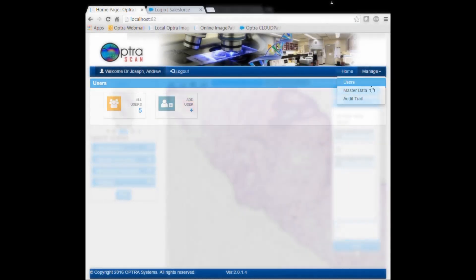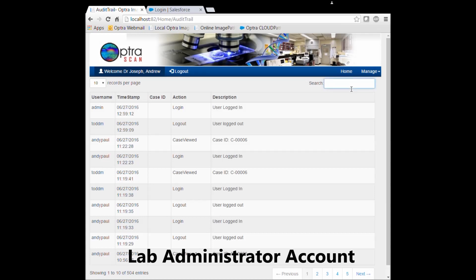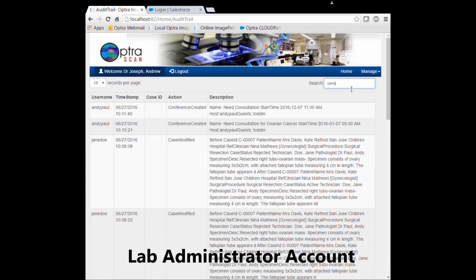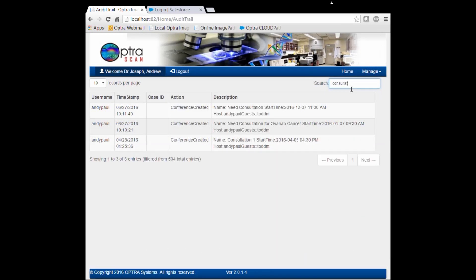Since we are 21 CFR Part 11 compliant, each user action will be time stamped in the audit trail for the lab administrator to access.